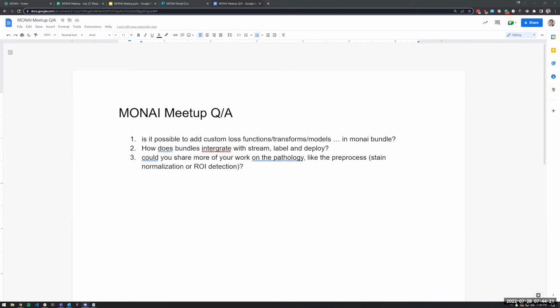But our objective is definitely to have those all seamlessly integrating with bundles, to be able to automatically go to a bundle, and all the code that needs to be done to make that work in that particular context will be automatically generated from the metadata that the bundle includes. This is the whole idea: we should have enough rich information in a bundle to be able to automatically do a lot of the stuff that you'd have to do manually, and eliminate boilerplate and other nastiness that no one wants to deal with.